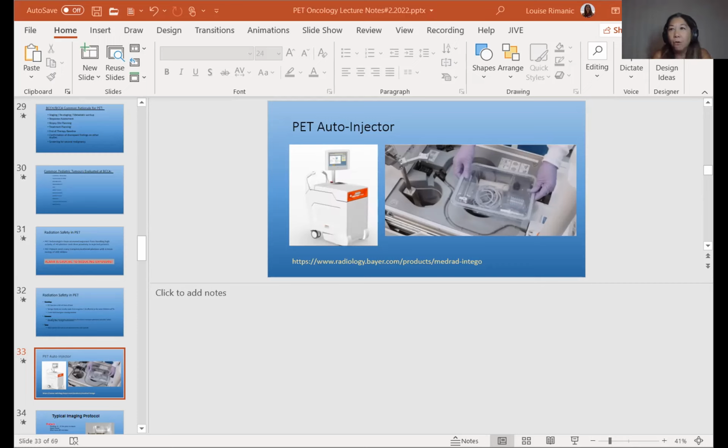However, if there is a focal uptake in any of these organs, then it has to be investigated as a possible malignancy. Okay? But if it's just sort of uniform and variable and diffuse, then we don't get too concerned.